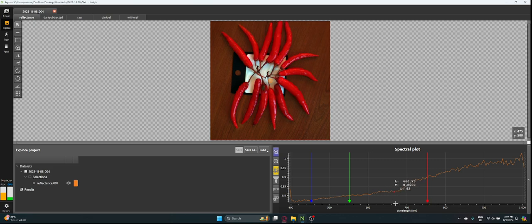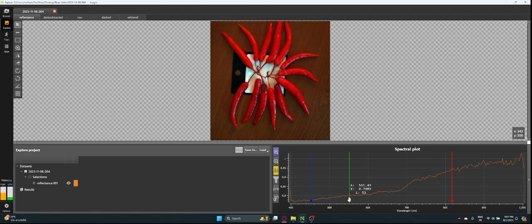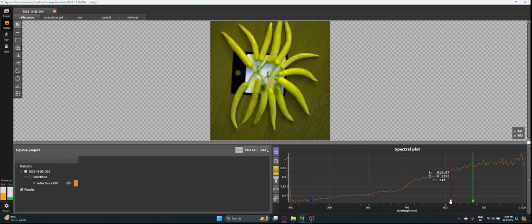For example, I just pull. See, you can see now there's bruises here. If I pull it back down, earlier where was it? Here. It's not too obvious. So just pull it, and then you can see over here there's bruises. Pull green, even better. Now you can see there's some spots here which you cannot see in red. Actually, you can see, just not too obvious. So of course you have to play around with this a lot. It's just a way of viewing things. You can set it up differently as well. Just trying to get used to this.